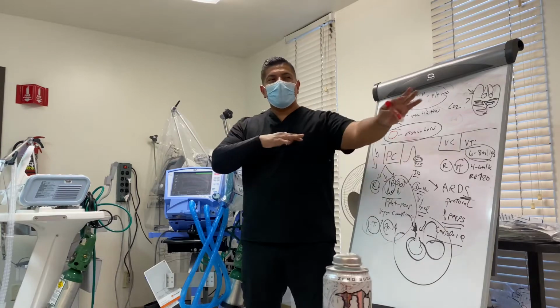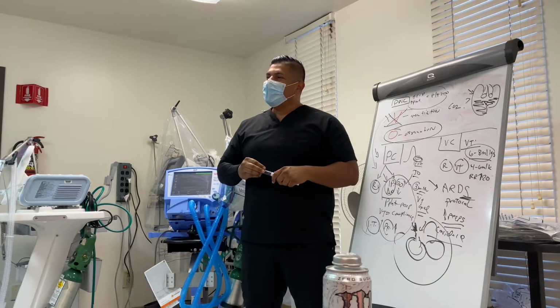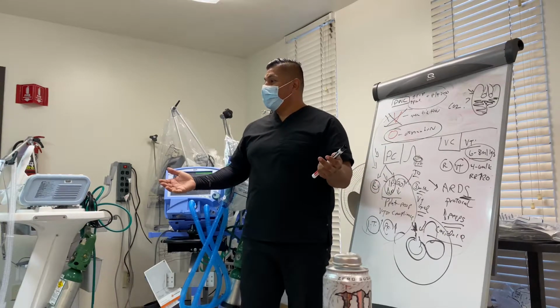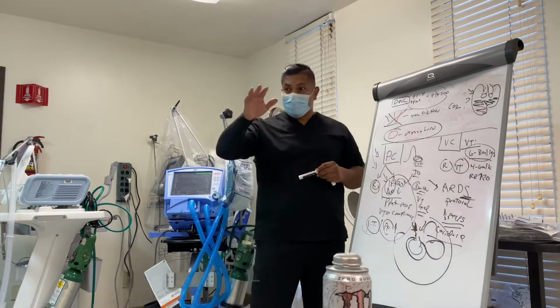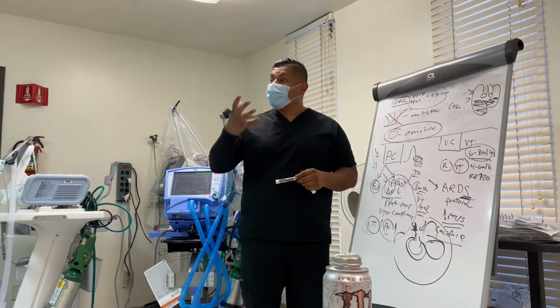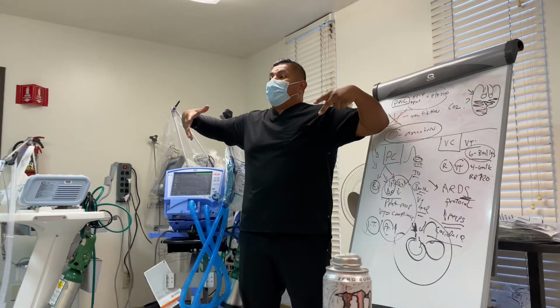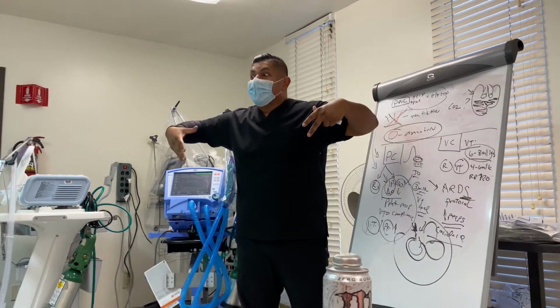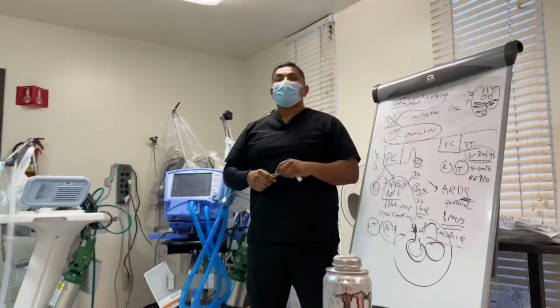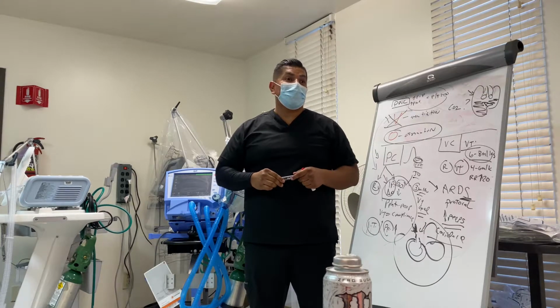Do you remember in the beginning, back in like February or March, we had the ventilator shortage? Anybody know why? Because we were afraid of spreading this virus. So if you didn't tolerate 6 liters nasal cannula in the acute setting, I was not going to put you on BiPAP because BiPAP has that leak. And now I'm inflating an infected lung, and when they exhale, where's it going to go? We didn't know what was going to happen. So we tubed everybody. Yeah, that's what I heard. That's what led to the shortage of ventilators.